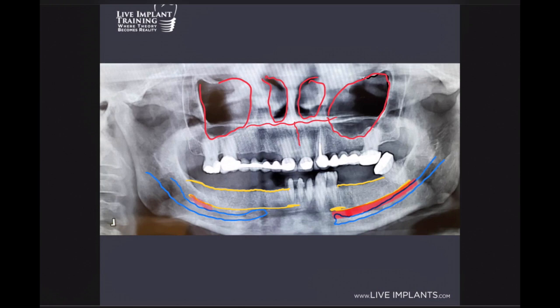We're going to outline about two to three millimeters superior to the inferior alveolar nerve and trace our safety zone. Let me erase that incorrect part — there we go. That's our safety zone right there.